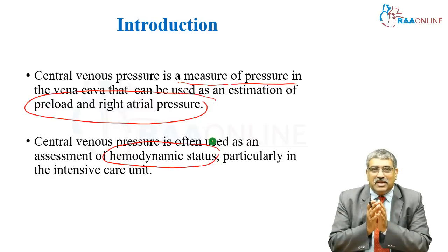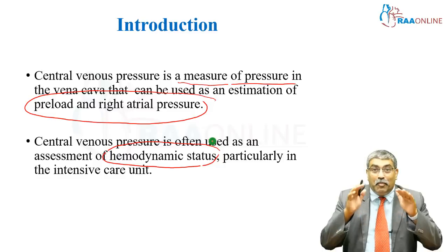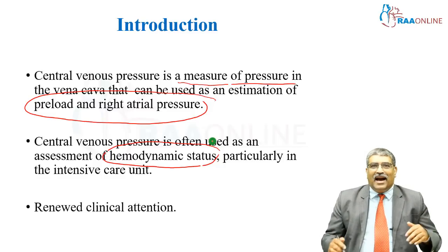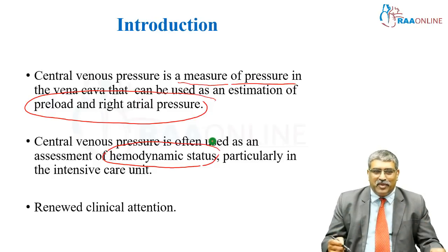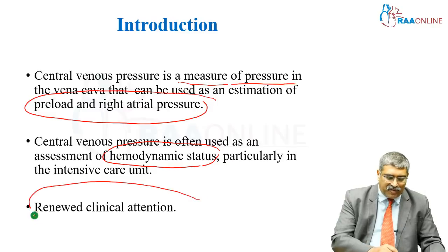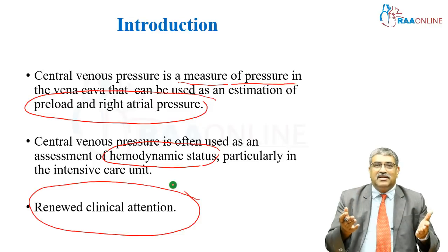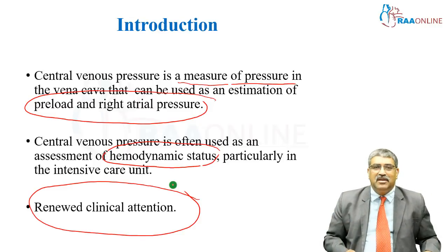Not only does it help in assessment of hemodynamic status, but also in the management of hemodynamic instability. As newer modalities and technology are coming into the picture, a lot of renewed clinical attention is given to CVP. Now you can monitor the central venous oxygen instead of mixed venous oxygen.